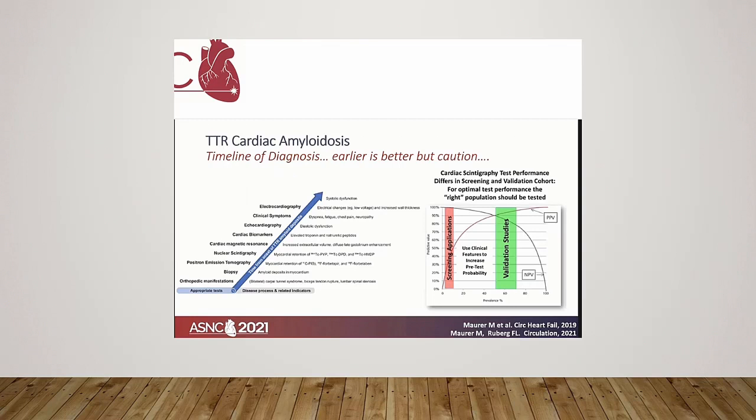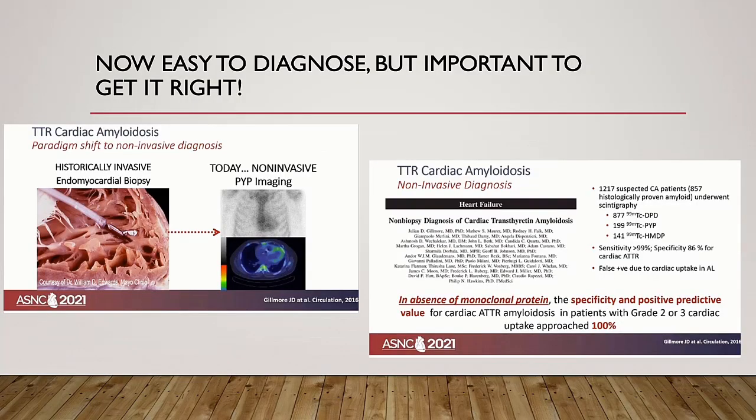Where does scintigraphy sit in the diagnostic algorithm? It sits just after cardiac PET, but before cardiac MR, echocardiography, or even the development of symptoms. Therefore, it can accurately make a diagnosis early, enabling the early initiation of life-saving therapy. In addition, scintigraphy is far safer than myocardial biopsy. It is cheaper, more easily performed, and is simple to do.